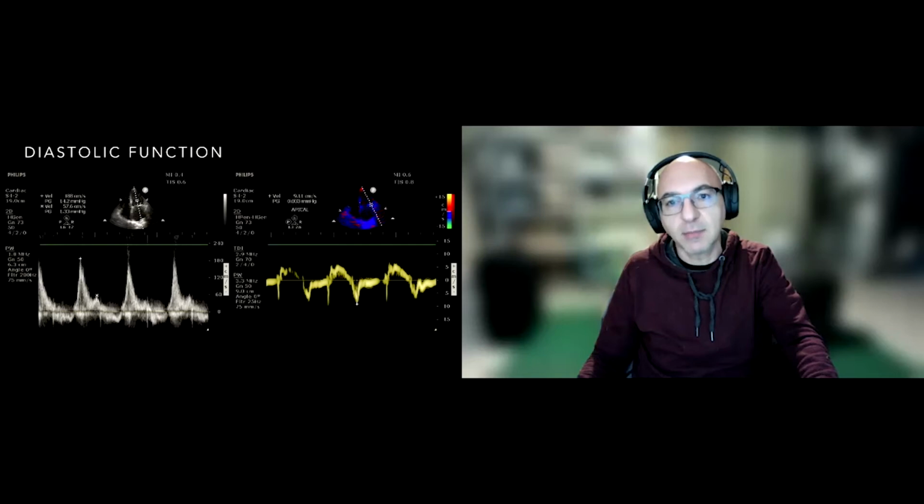But if you end up with a patient who has pulmonary edema and you measure their wedge pressure and it's normal or low because they haven't eaten for a couple of days and their kidney function is bad, then I'm just going to put them on CPAP. I'm not going to diurese them at all, or BiPAP, and I'm going to keep cranking up the pressure, and maybe support them hemodynamically with pressors in that case, if they need it.